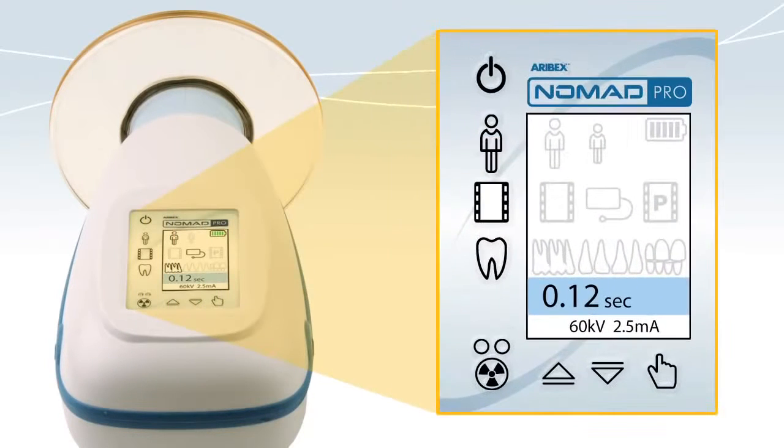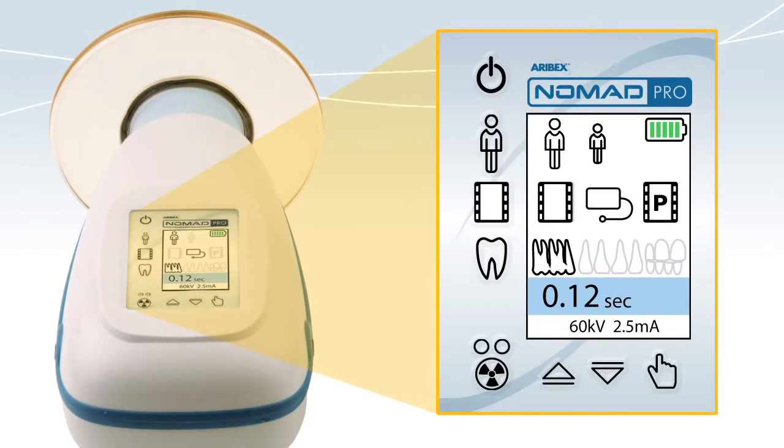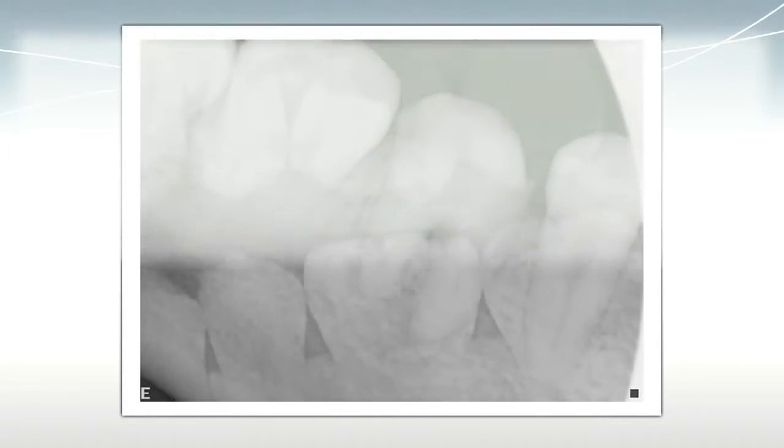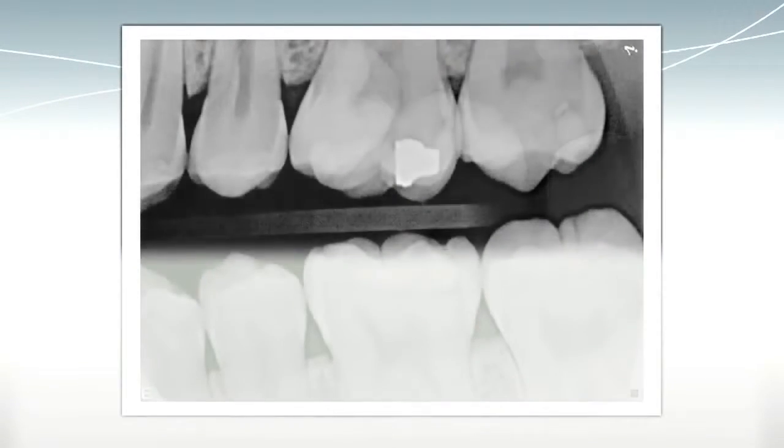Nomad Pro's control panel is easy to use. In the upper right is the battery indicator. On the left are adjustments for adult or child patients, film, digital sensors or phosphor plate receptors, and anterior, posterior or bite-wing views. The exposure time is preset, but it can also be adjusted and saved manually.